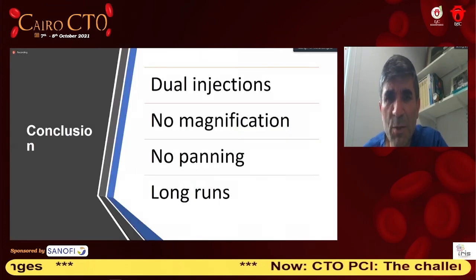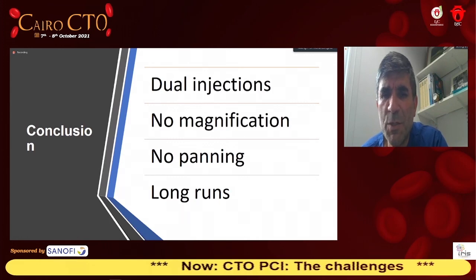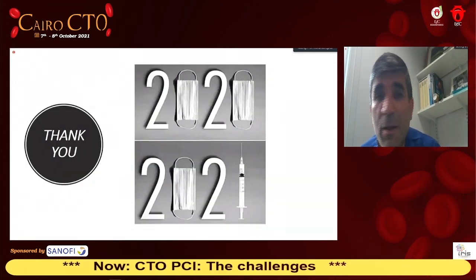And with this, I say thank you. Again, just a quick summary: dual injection, no magnification, no panning, and long runs. And that will hopefully give you all the information you need. And I thank you very much.